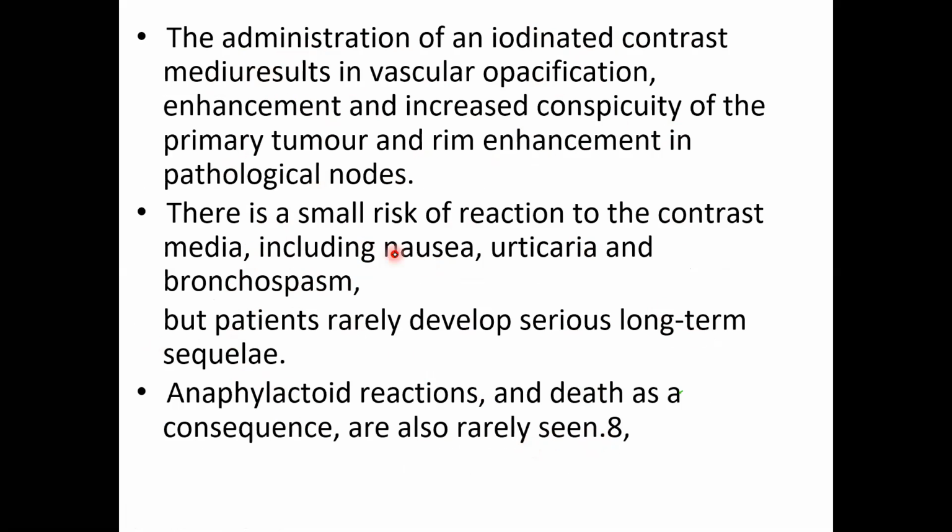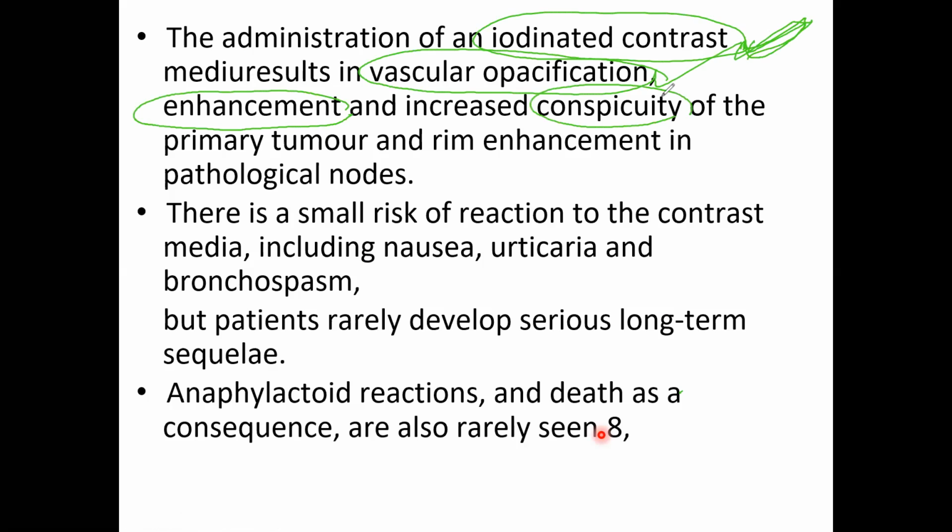Very importantly, you should have in mind this iodinated contrast. It helps us in vascular opacification. This is called a CECT, with vascular opacification, enhancement and conspicuousness of the primary tumor.